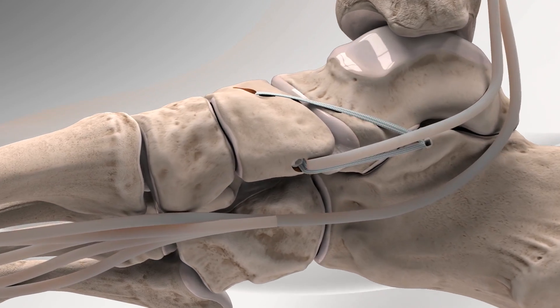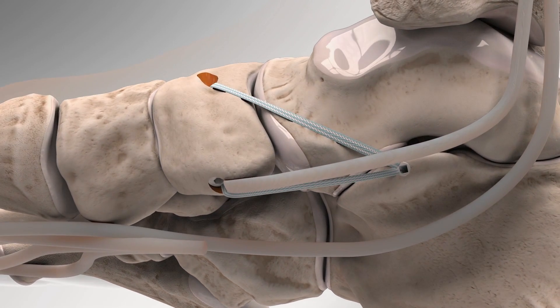The supporting structures of the arch of the foot are now repaired and held together with the internal brace, causing the arch of the foot to be restored.